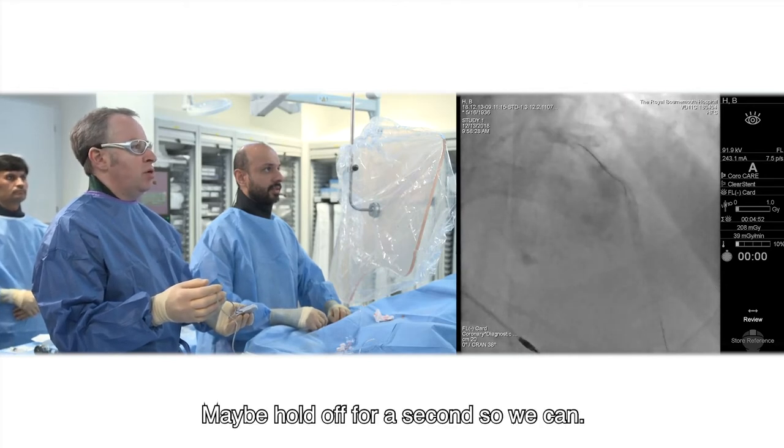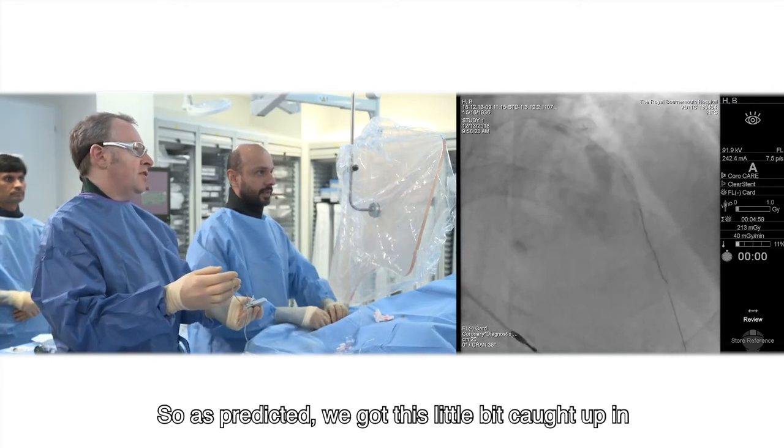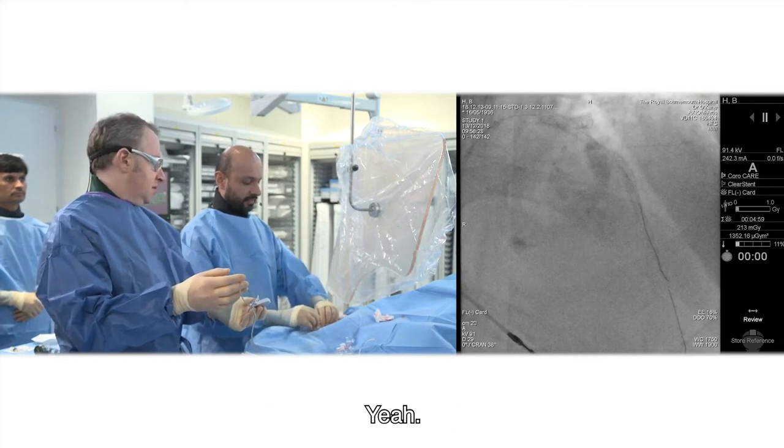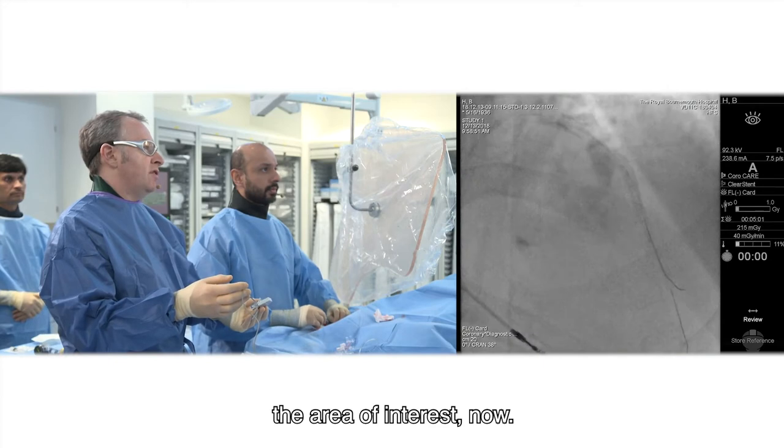Maybe hold off for a second. So as predicted, we got caught up in the stent struts. Just advancing our way through the area of interest now.